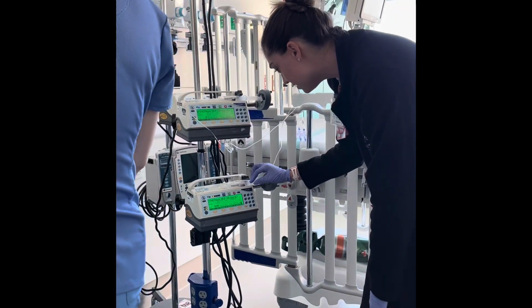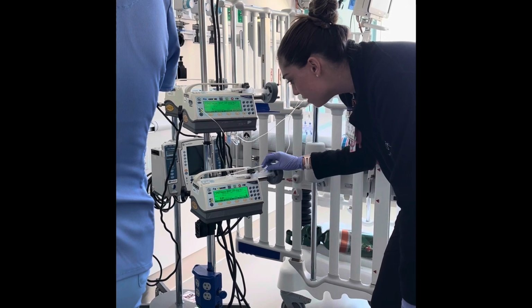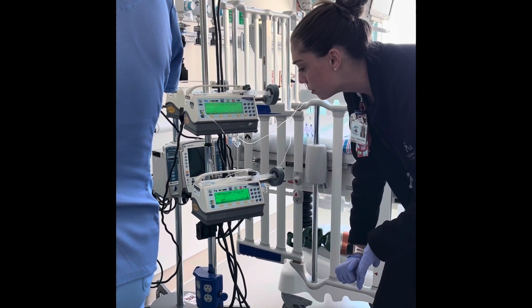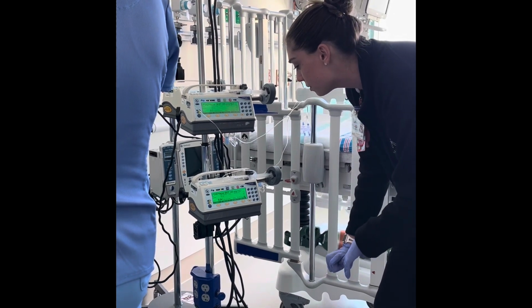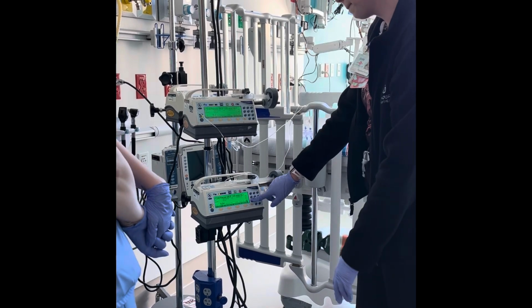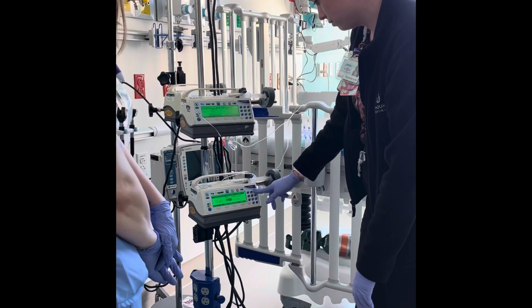All right, this is Mikey Mouse, 1, 2, 3, 4, 5, 6, 7. Epinephrine, 25 mics per mL. Weight is 10 kilos, dose is 0.04 mic per kilo per minute. Rate is 0.96 mLs an hour. Correct. You will continue to wean this until you have weaned the old infusion off.